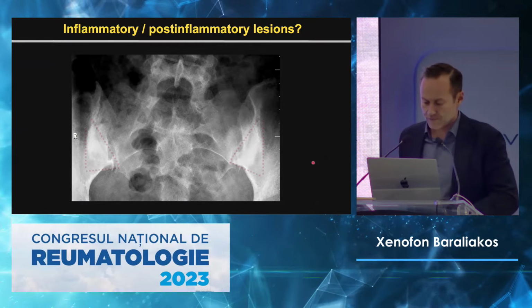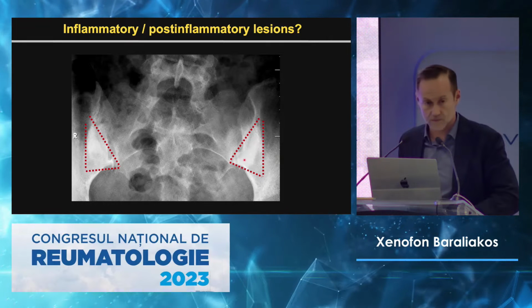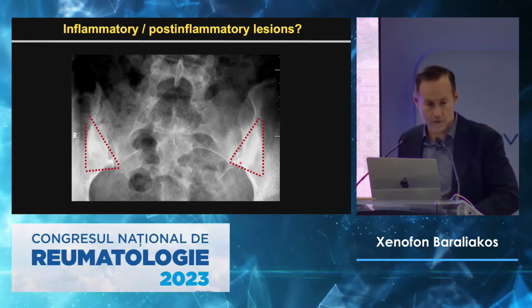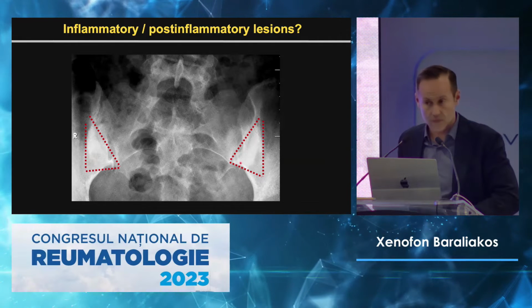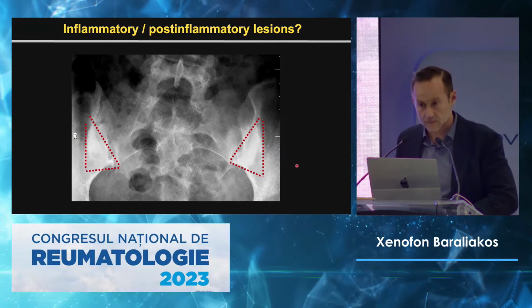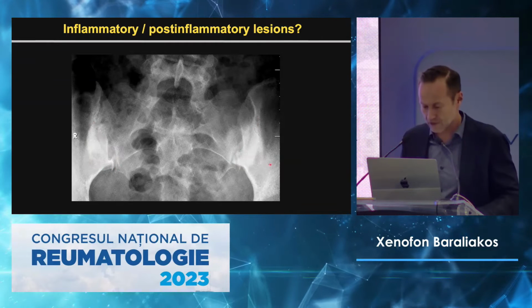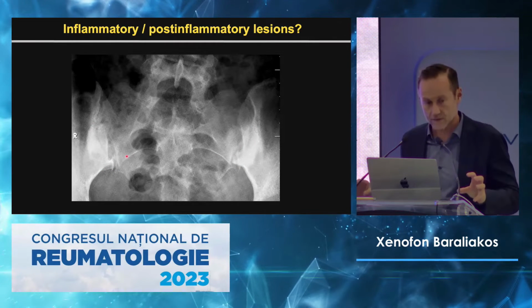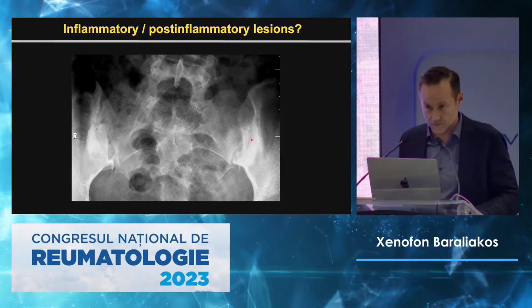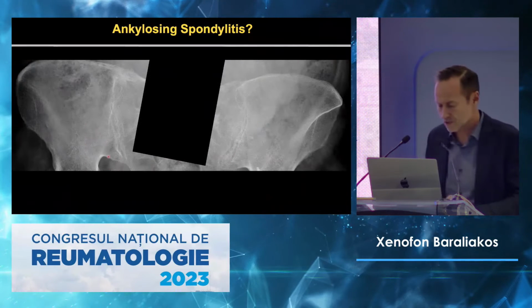And you may also have this kind of thing, where you have a lot of sclerosis, bilateral or unilateral, in a triangle form. And if I now ask you, can you imagine what that is? It's a typical osteitis condensans finding. Yeah? You have a bilateral involvement, it's symmetric, but, well, here we cannot see it, but it doesn't really affect the line of the joint. It doesn't really widen it much. So it's a typical osteitis condensans.